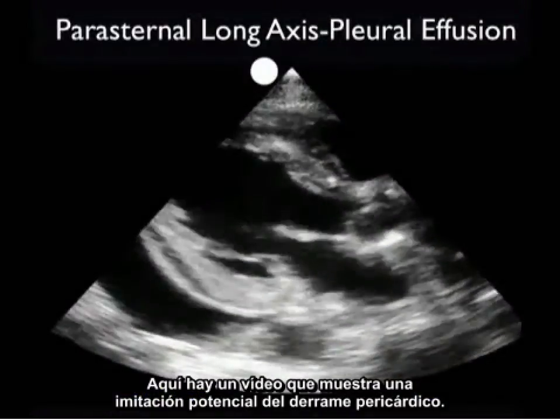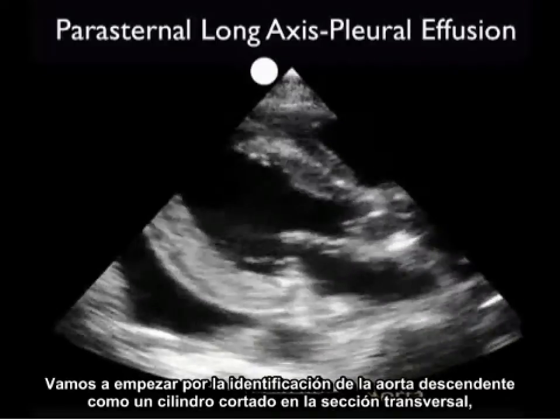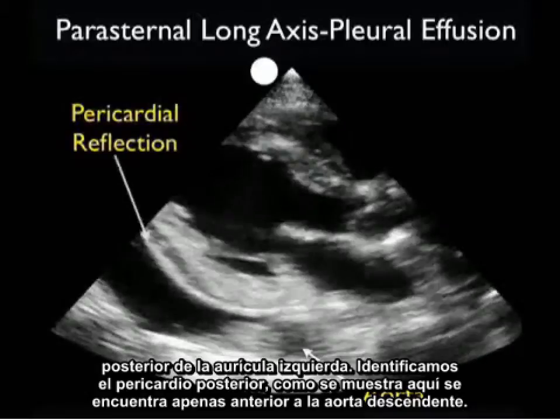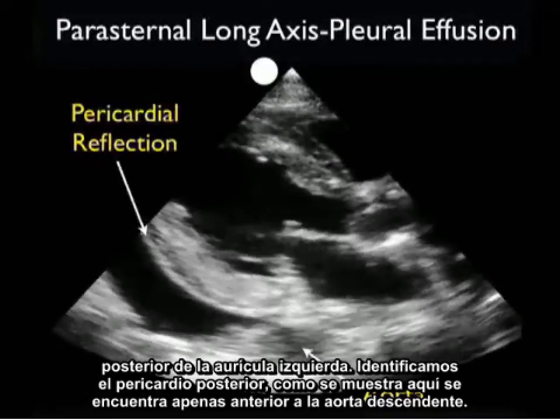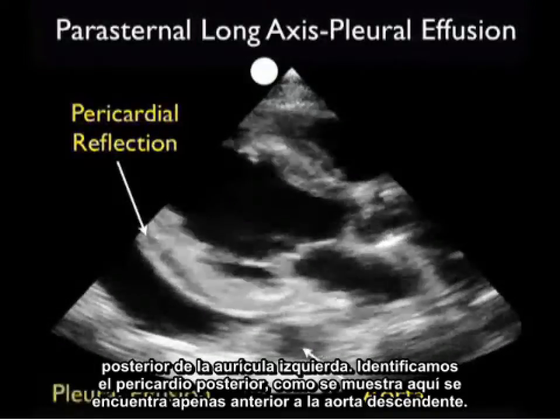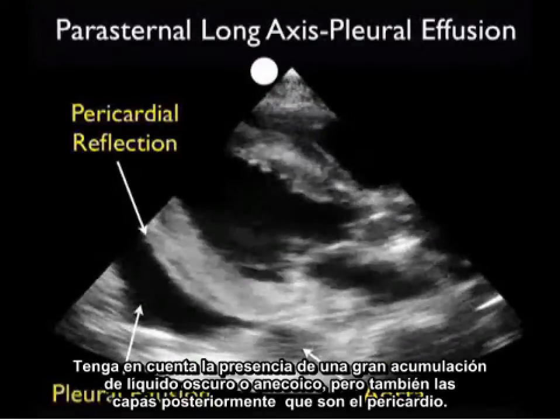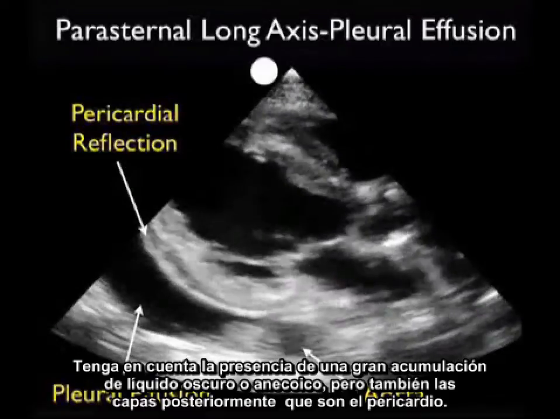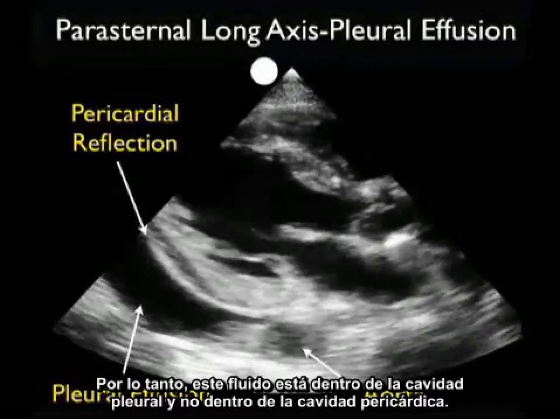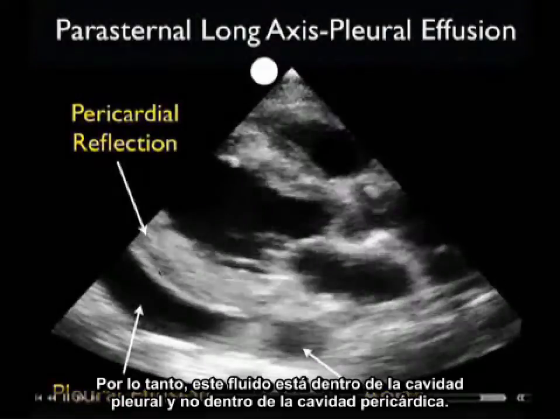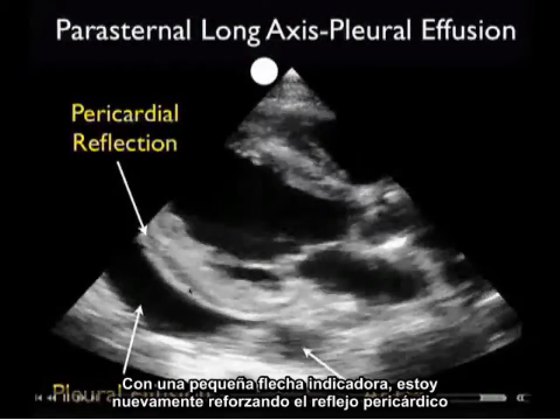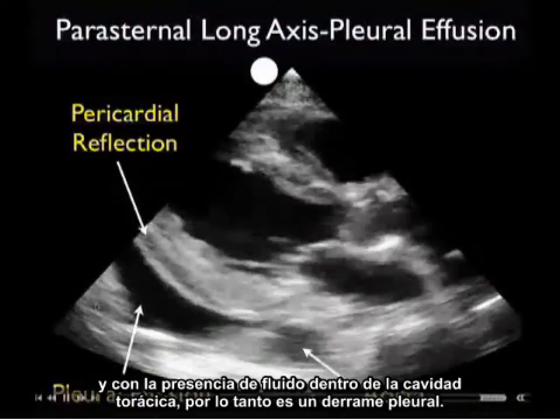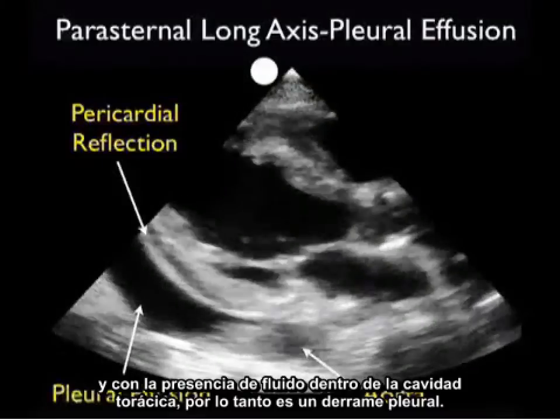Here's a video clip showing a potential mimic of a pericardial effusion. We identify the descending aorta as a cylinder cut in cross section posterior to the left atrium, and the posterior pericardium coming off just anterior to the descending aorta. Note the presence of a large dark or anechoic fluid collection, but note that it layers out posteriorly to the pericardium — thus this fluid is within the pleural cavity and not the pericardial cavity, representing a pleural effusion.